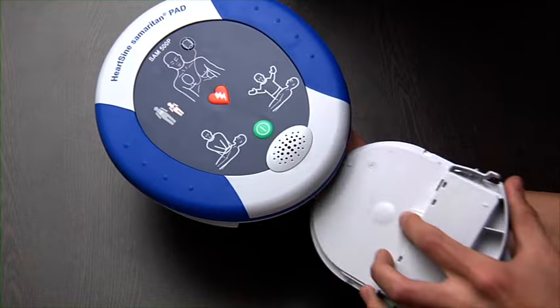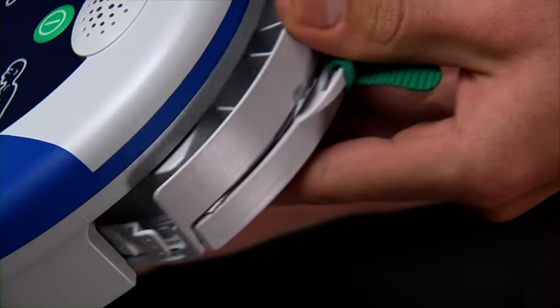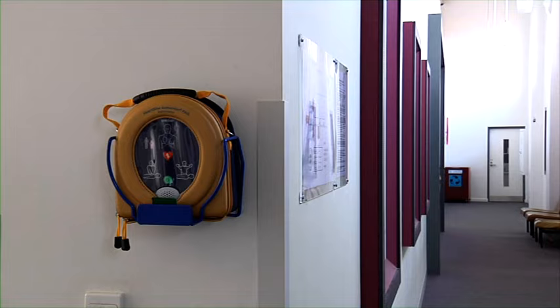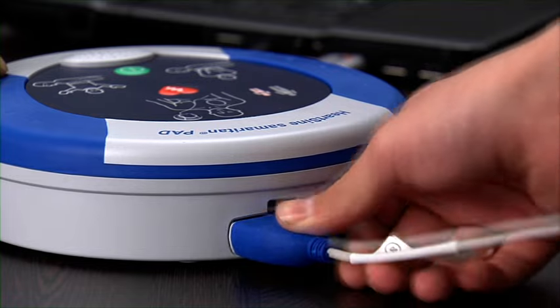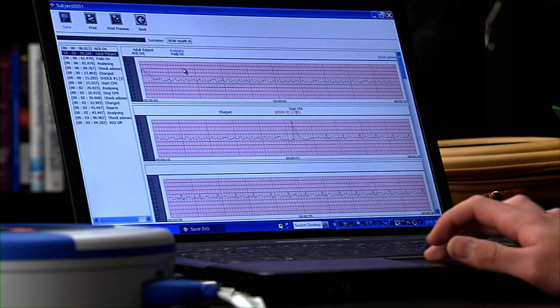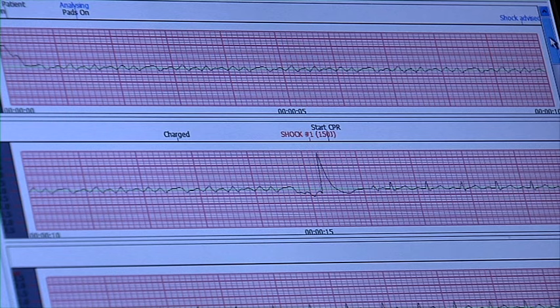After using the AED, the pad pack must be replaced with a new one. Then return the AED to its original position. If you have the optional data management package, you can download the recorded event using a cable and the Saver Evo software.